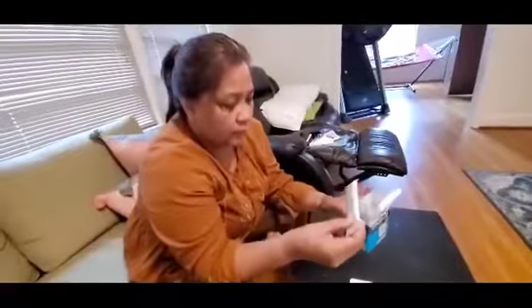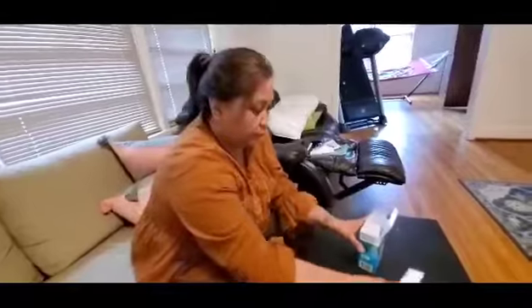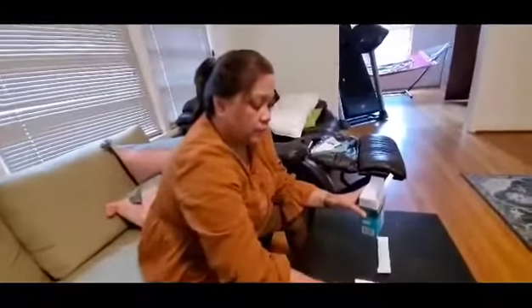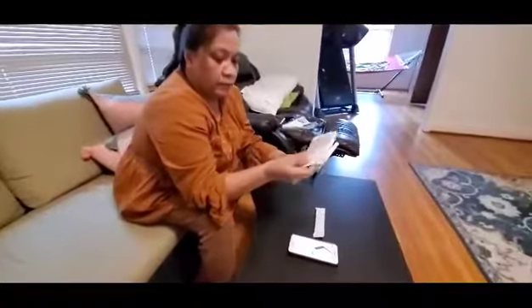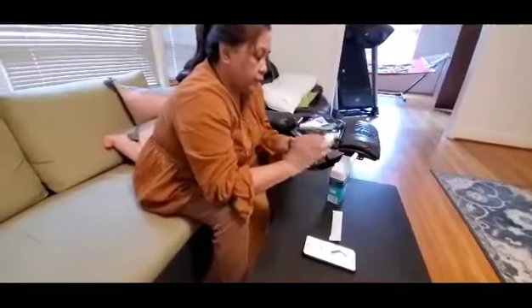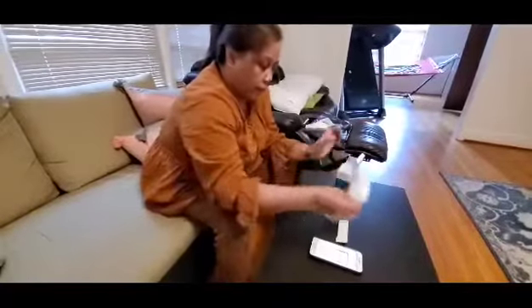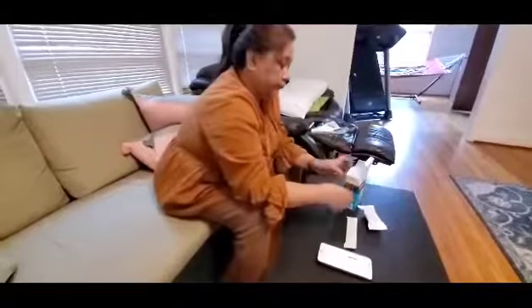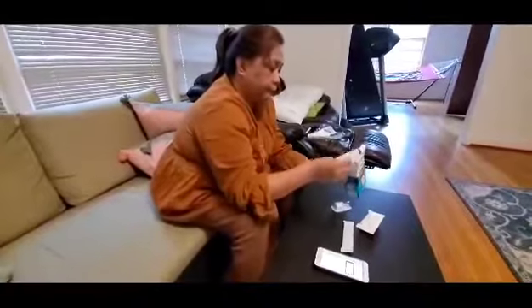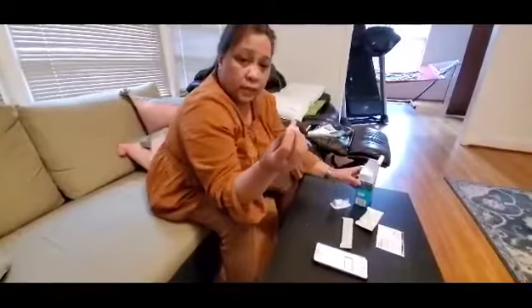Then I open this. This is the analyzer. That's my cell phone. This is just some instructions. This is the dropper. And this is the swab kit. And then this is the reagent.